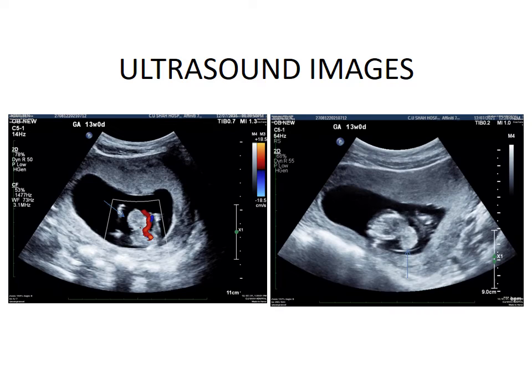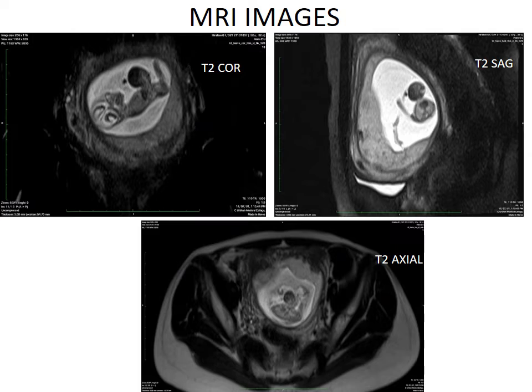In this ultrasound image, we can see the umbilical cord is inserted directly into the herniated pouch. Fetal MRI images show a large hernia sac protruding through the ventral wall of the abdomen, with liver and small bowel elements seen in the sac covered by a thin membrane.